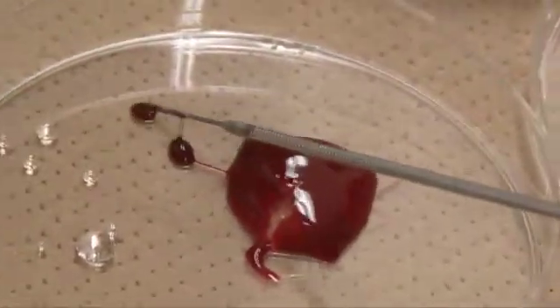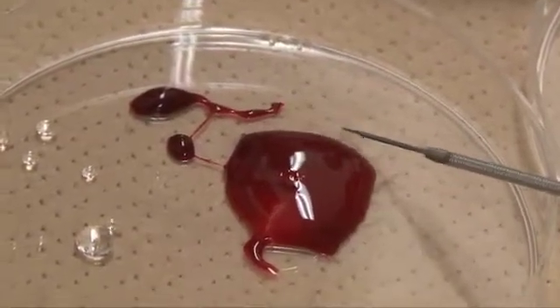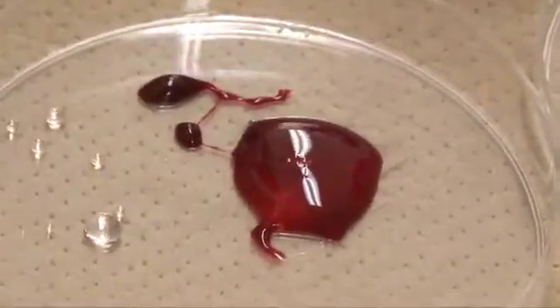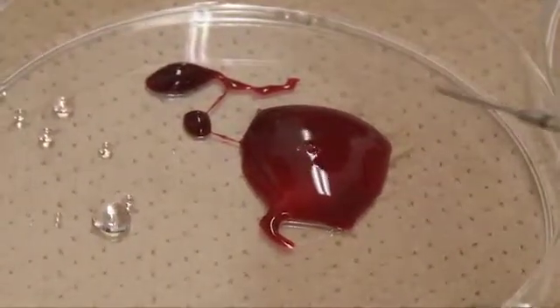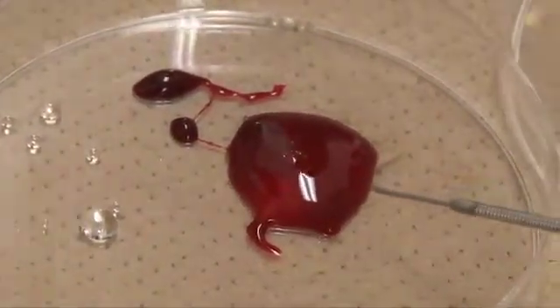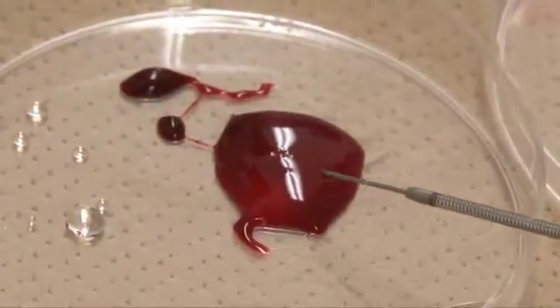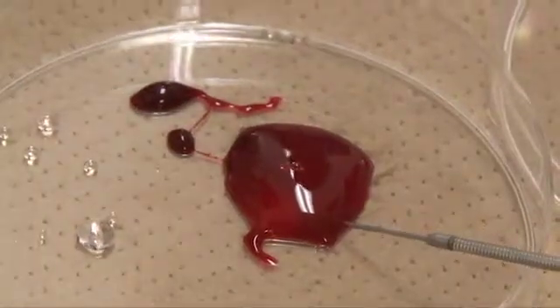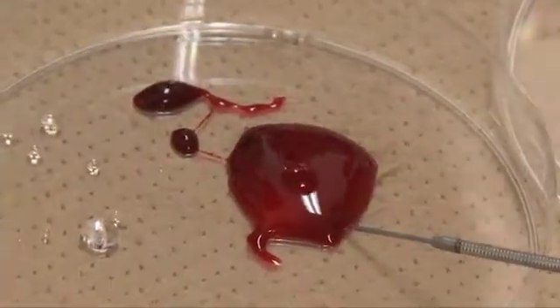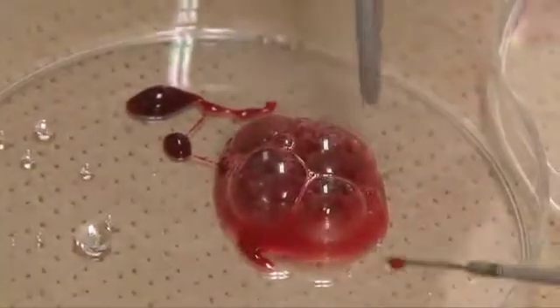But if you pull all the way out and then redirect, then you can get different trajectories. So it's best to pull all the way out of the lesion into the soft tissue around the area, change the trajectory, and then go in. If the needle is kept very much in the lesion, you really can't vary the trajectory much with either the elevator or the up-down dial. Okay, thank you very much.